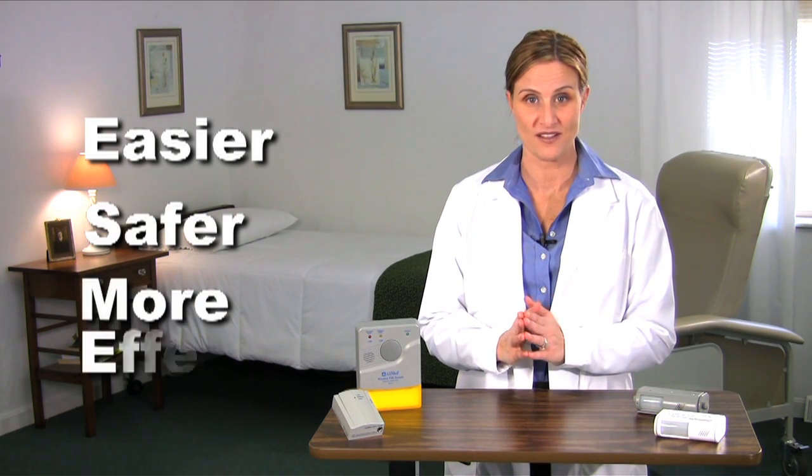Hello, I'm Heidi Young, a member of Alimed's customer outreach team. As a member of that team, I visit many healthcare facilities and we really listen to what you have to say. Alimed wants to make your job easier, safer, and more effective.